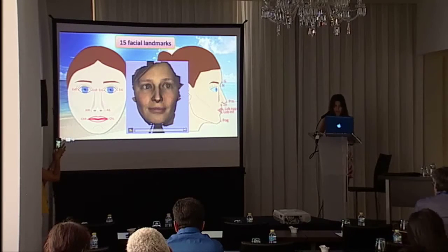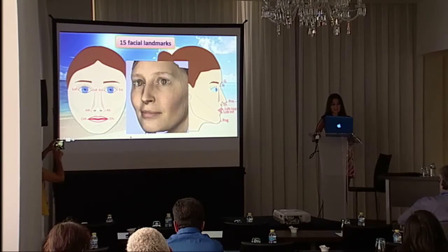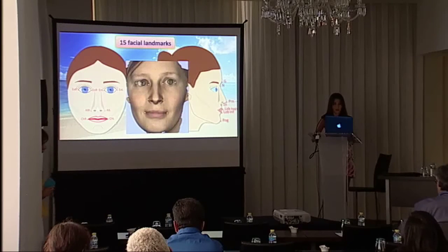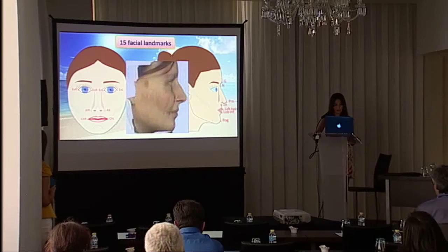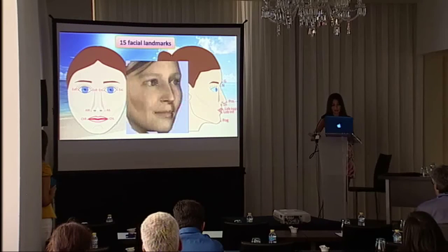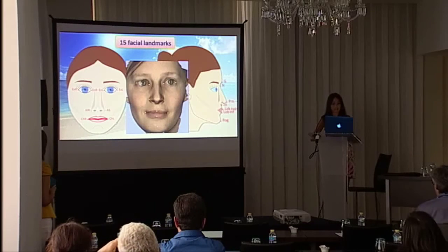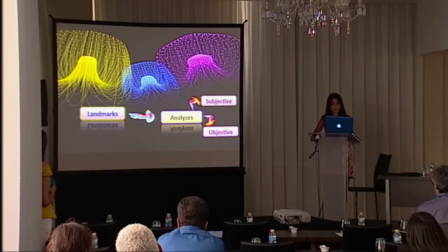I will show you here how the landmarks have been placed on the virtual reconstructions in 3 dimensions. So we're placing the paired landmarks, and now the single landmarks. You can see we can rotate the face and zoom in and out. Okay. So here we're done placing the landmarks, and this is the final face with all the landmarks needed.